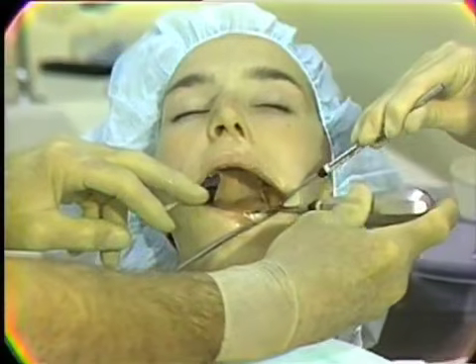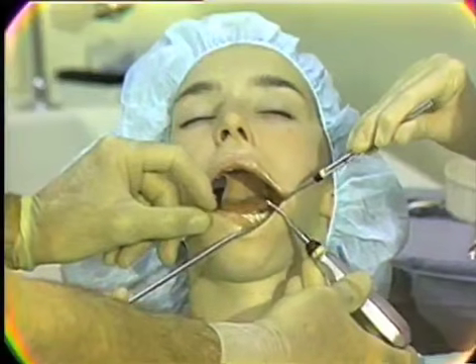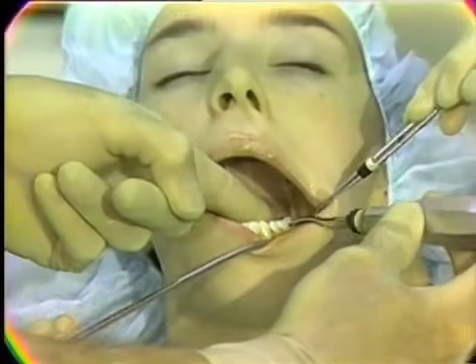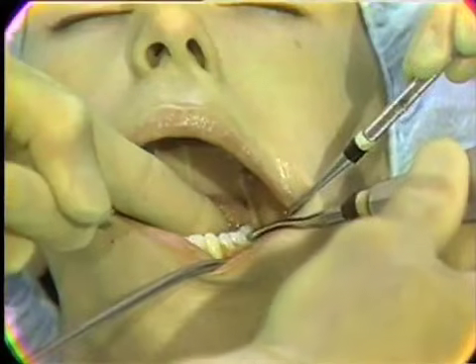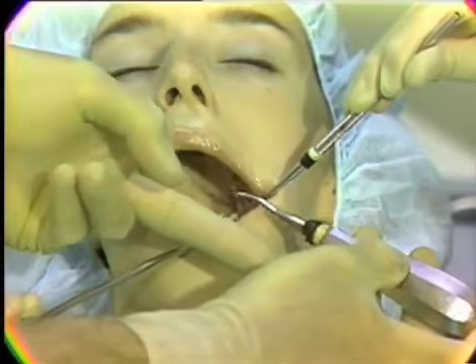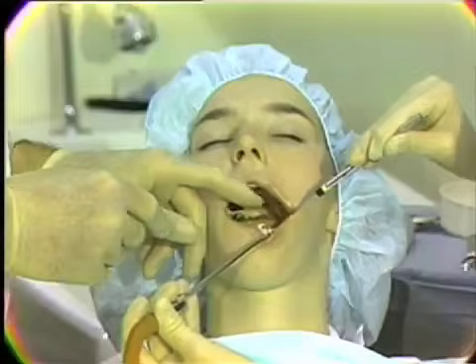When using an elevator that tends to have a sharp blade, another method to safeguard the patient against the potential abuse and accident of these instruments is to place your finger on the lingual aspect opposite where you will be placing this elevator force. Then in the event of an inadvertent slip, it's obvious that you're going to stop instead of burying that instrument in the patient's soft tissues of the tongue or floor of the mouth. These then are methods in which the mandible can be supported.